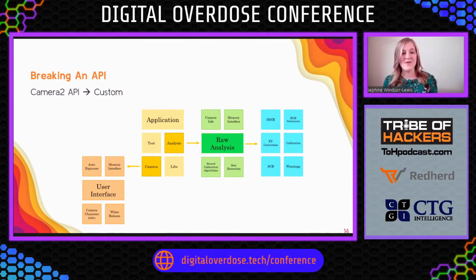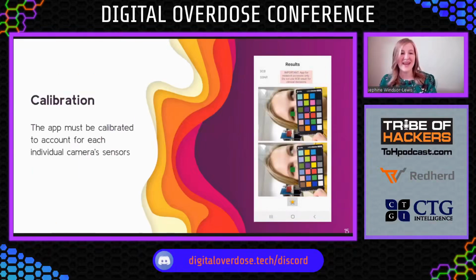We subtract the image, we look at the sample area, we figure out the exact values coming in from all those different light sensors. We average it to get a color reading in RGB and also an XYZ chromaticity reading. And then we compare that, using a brilliant algorithm designed by the DJAN team, to various different color specs for how yellow is the eye. Is there a level of bilirubin there? Does this child have jaundice?